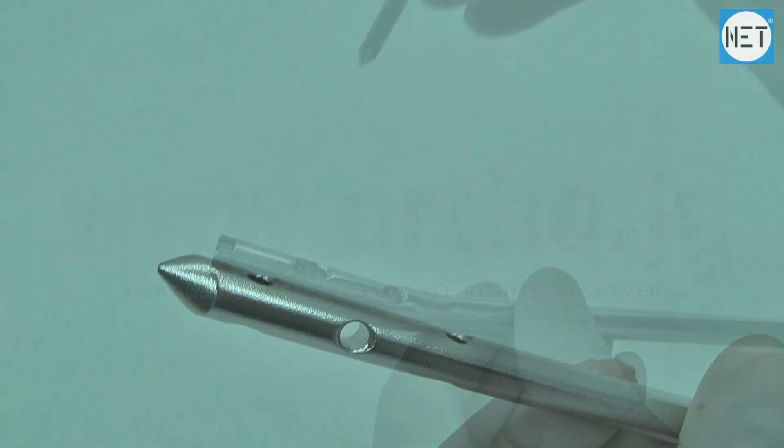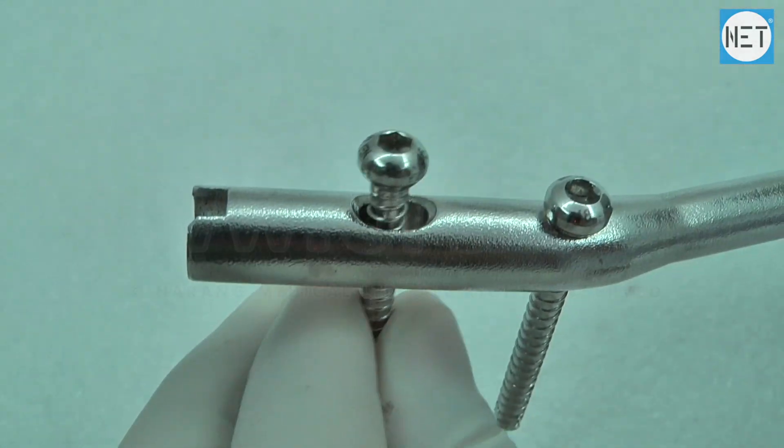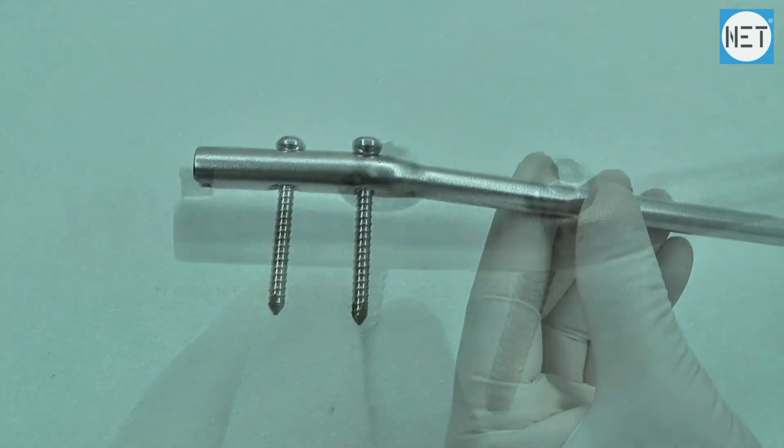First proximal hole from the top is dynamic and is directed lateral to medial. Second hole from the top is round and is also directed lateral to medial.